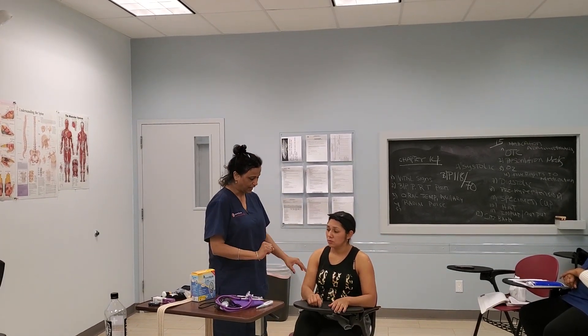Good afternoon, hi. I'm Miss Henderson, I am your nurse today, and today I'm here to do your blood pressure. Is that okay with you? Thank you. I'm going to go wash my hands and bring my equipment. According to the Center for Disease Control, we are supposed to wash our hands 15 to 20 seconds in order to minimize the transmission of infection.